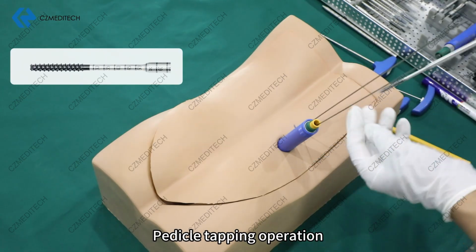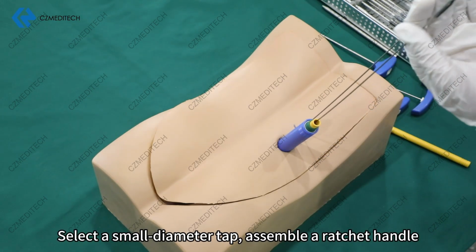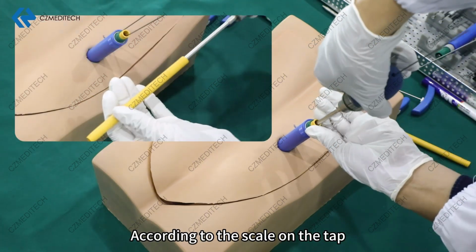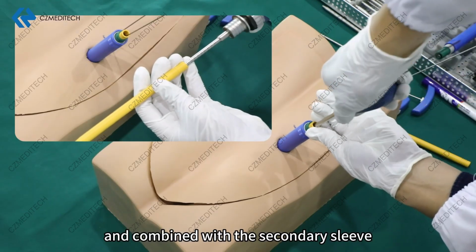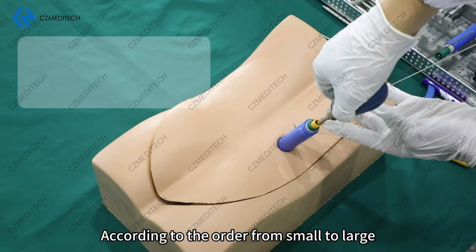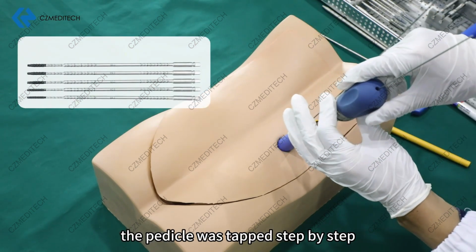Pedicle tapping operation. Select the small diameter tap, assemble a ratchet handle, and start tapping the pedicle along the guide needle. According to the scale on the tap and combined with the secondary sleeve, the tapping depth of the tap can be controlled. According to the order from small to large, the pedicle was tapped step by step.